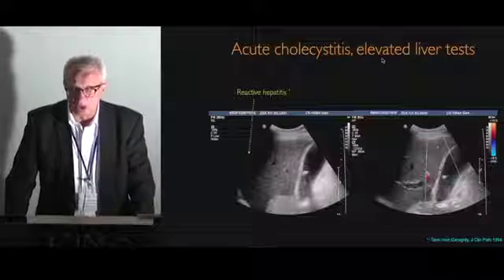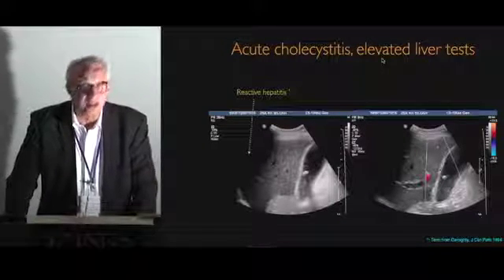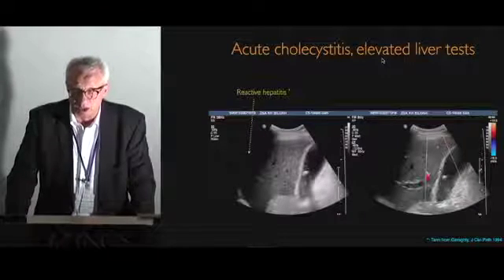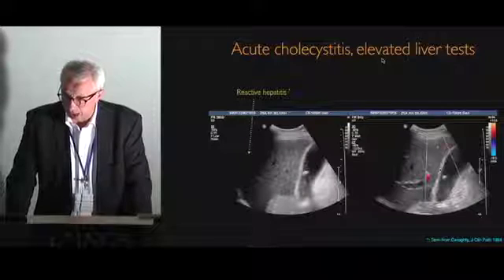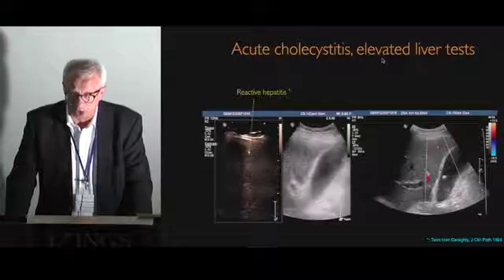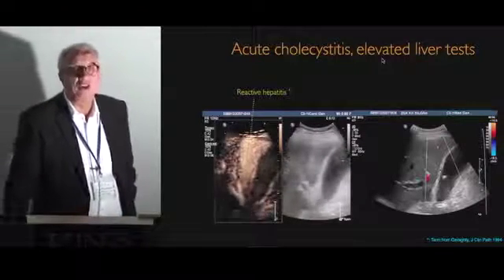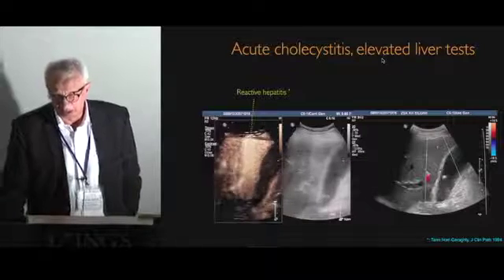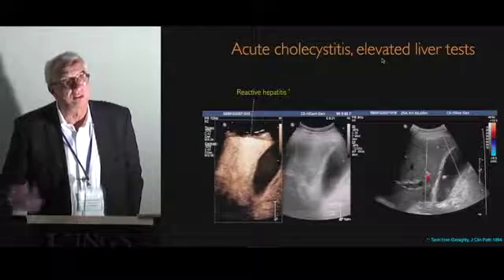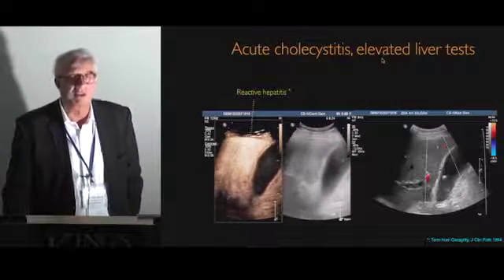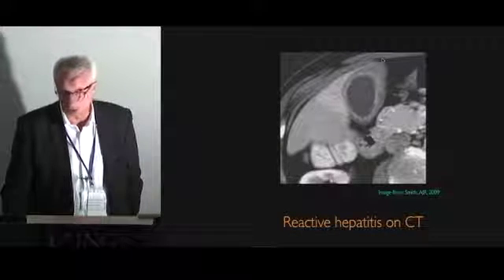This is just to show you acute cholecystitis with elevated liver tests. What we can see is what we named reactive hepatitis — a term used by Geraghty in clinical pathology in 1994. When we give contrast, you can see quite nicely the enhancement of the adjacent hepatic liver tissue — it is hypervascularized. That is a reaction due to the inflammatory process that you can see not only with CEUS but also on CT.